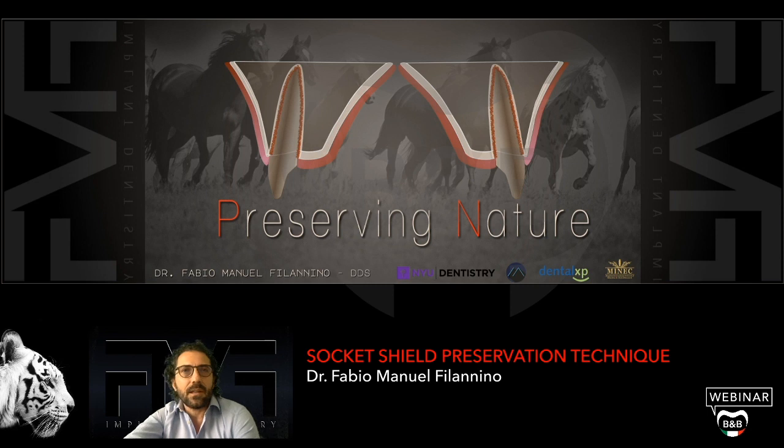I called this lecture Preserving Nature because we're going to talk about a surgical technique that we perform every time we have to extract a tooth to insert an implant or to maintain the three-dimensional architecture of the alveolar ridge.